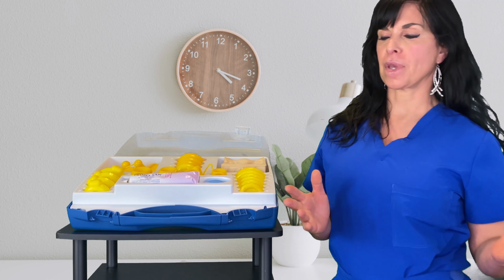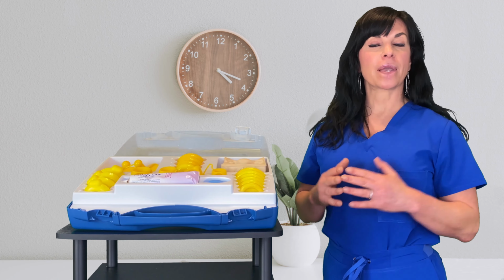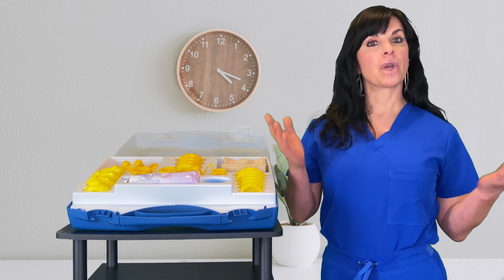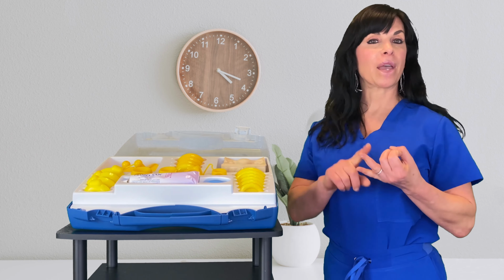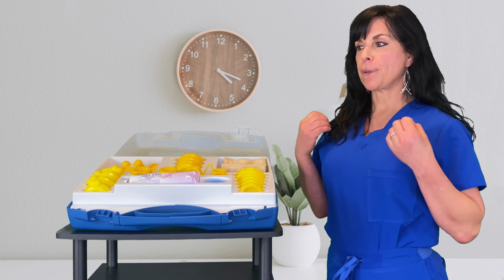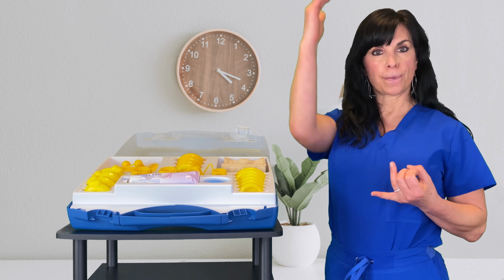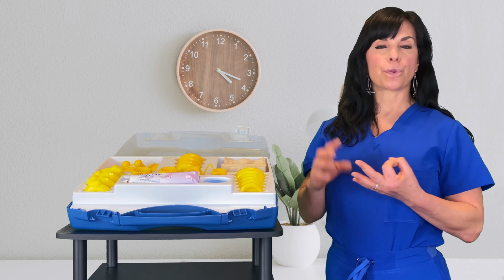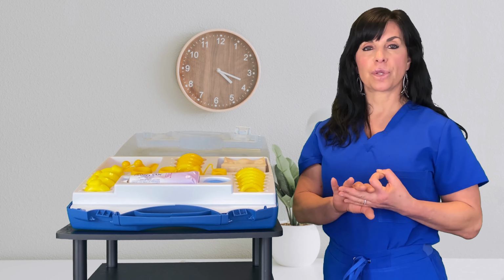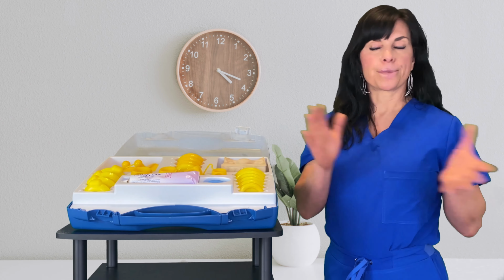What are pessaries? First of all, they are made of silicone and they're devices that can be used for the rest of your life to treat both stress urinary incontinence and prolapse. That can be prolapse of the vagina, where the uterus used to be, the top of the vagina, the bladder, or a rectocele, which is where the rectum is protruding into the vaginal wall. Or you can have all of them really.